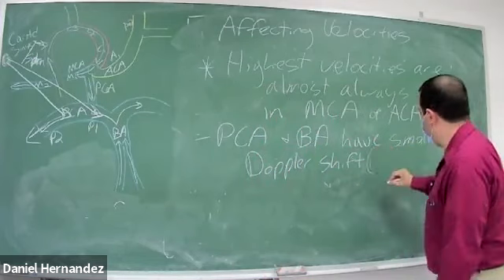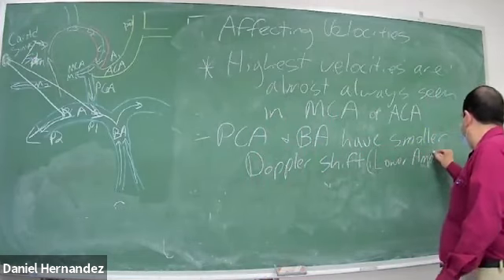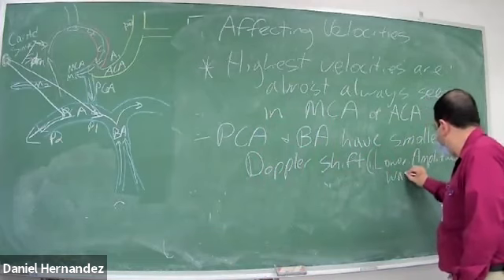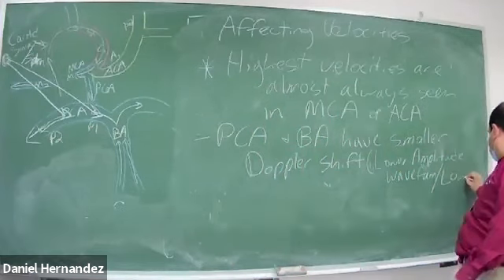So that's another way of saying lower amplitude waveform. It's another way of saying lower velocity.